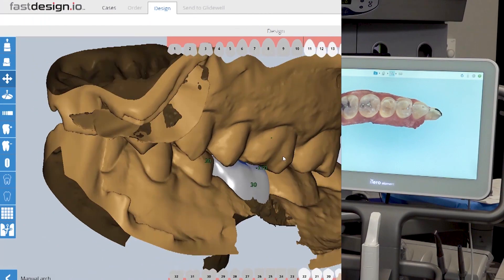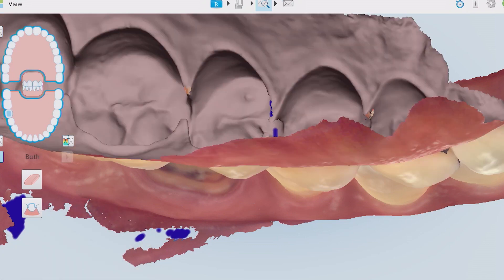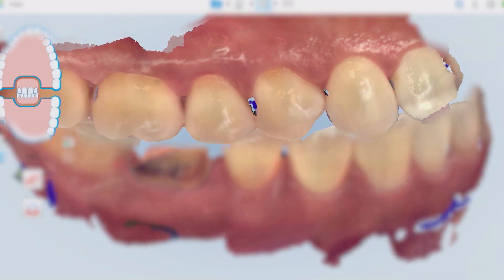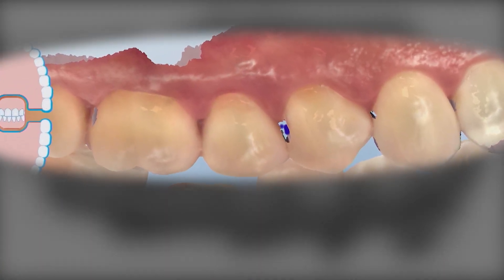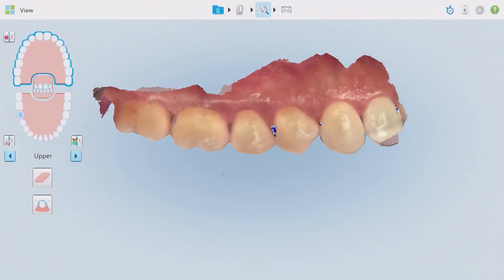It's going to be very difficult for the dental technician, or even for yourself if you're designing these restorations in-office chairside. It's going to be hard for your design software to know how high to build the restoration if some aspect of the opposing dentition is missing. So for the opposing, you can see here on the lower, I scanned again from the last tooth to at least the canine on the mesial side. We want to try to establish the same number of teeth on the opposing — you can see I have number six scanned in here all the way back to number two. We want to ensure that most of the occlusal and the buccal and lingual surfaces of the opposing model are captured.